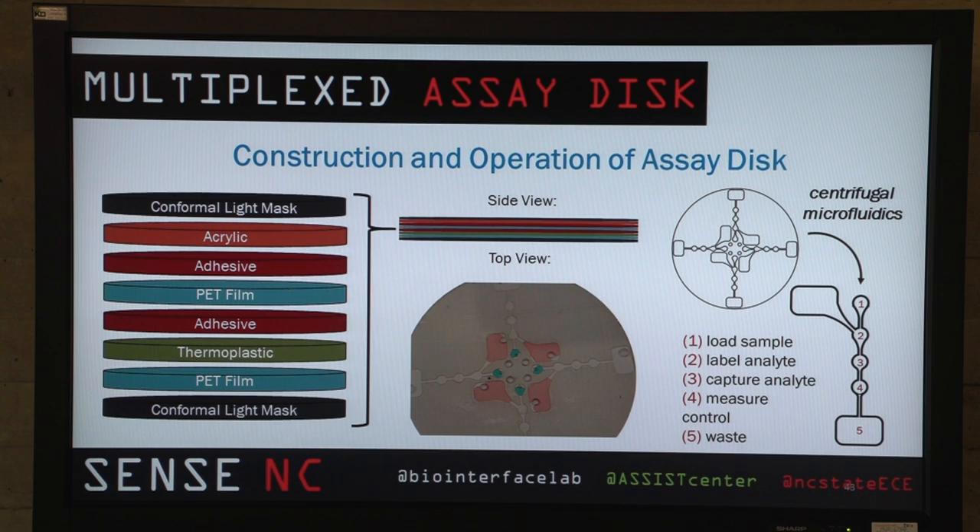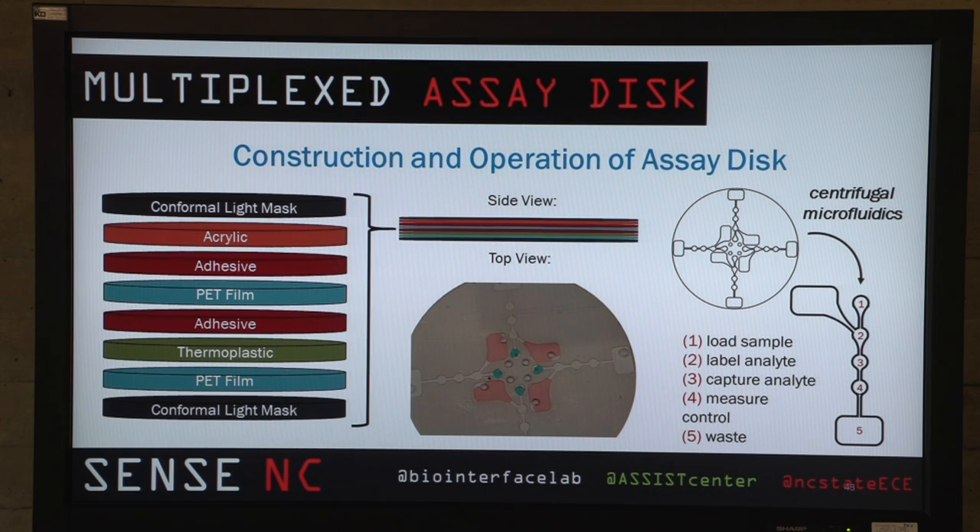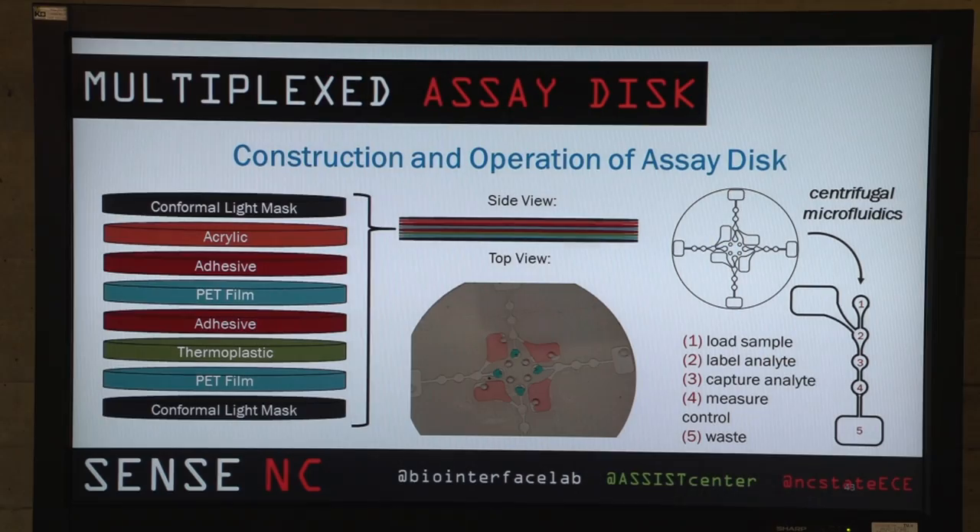This is the disk. It consists of four total microfluidic channels. Within each channel are four different chambers. The loading chamber, marked as one, is where we load the sample in. In well number two, we have the detection antibodies waiting to complex with the analyte in the sample. Well number three is where they meet the capture analyte and are bound there. The fourth well is a control to make sure the test fluid ran all the way through the device. The fifth marked well is a waste well that catches all of the integrated wash buffer loaded in the reservoir to the side.